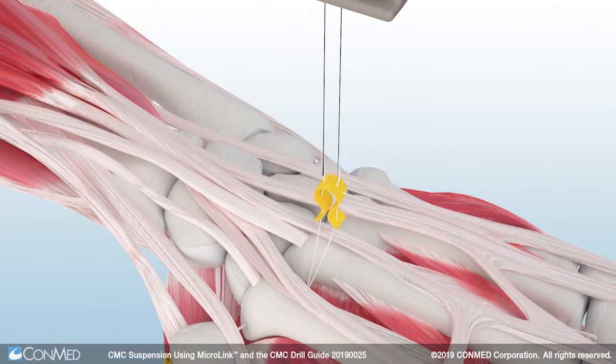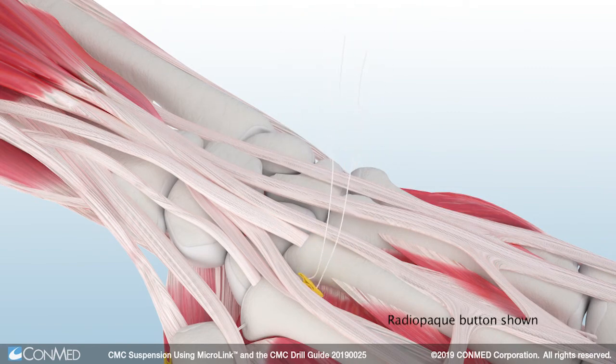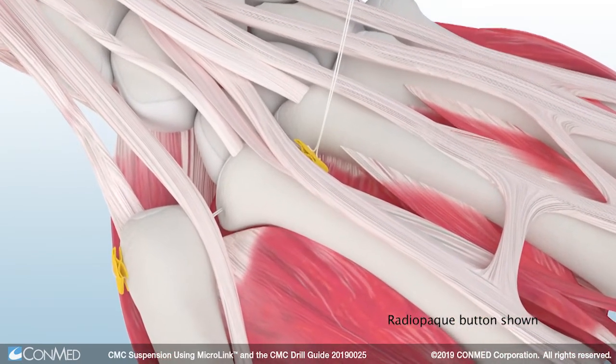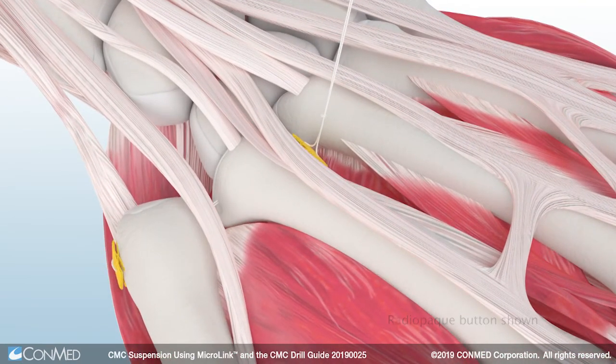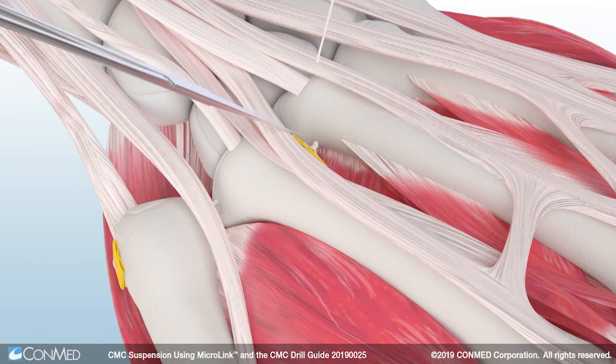Gently slide the backstop off the loader and onto the suture limbs. A half-throw can be used to advance the backstop down to the index metacarpal. The radiopaque Microlink all-suture button allows for visualization of repair under fluoroscopy. A minimum of five knots is required to ensure fixation. Suture tails are then cut and the repair is complete.